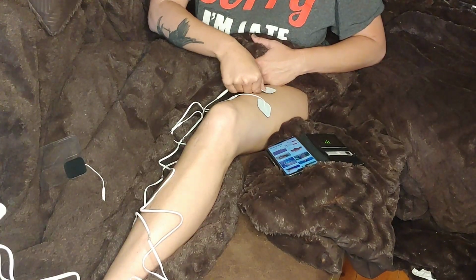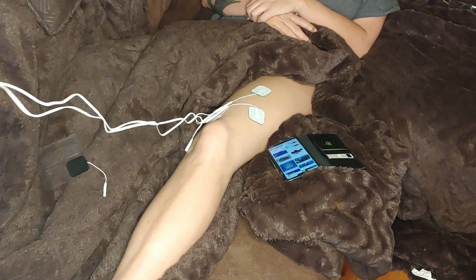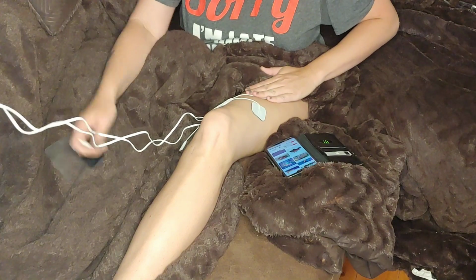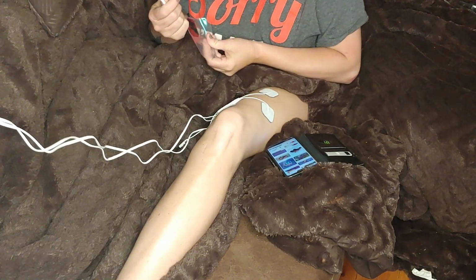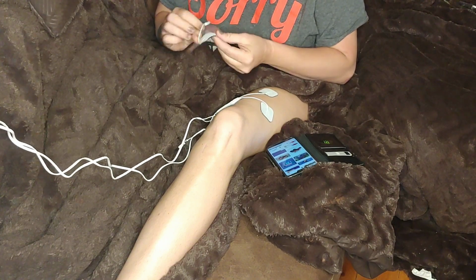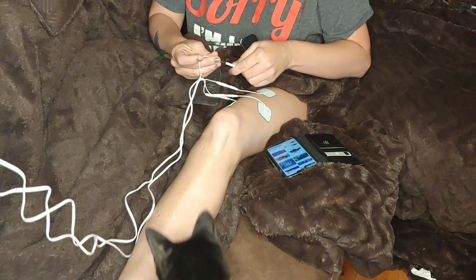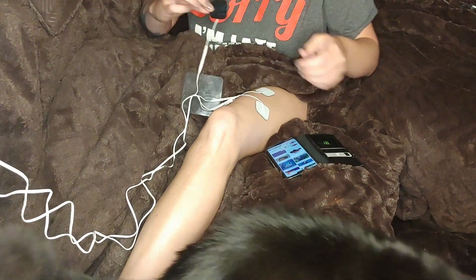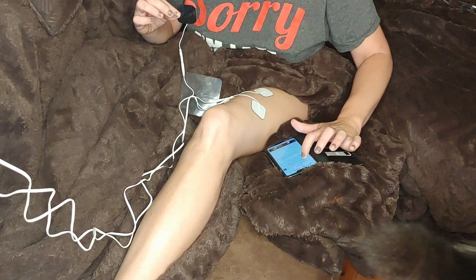Now, because of this surgery, and okay, you're going to need the other one too, baby. You have to make a circuit. That one won't do anything without the other one. Yeah, it's the positive and the negative. So anyway, because of this, she has torn a hamstring muscle because her quad is not firing, and the hamstring is having to take on too much pressure, and it tore her hamstring muscle.